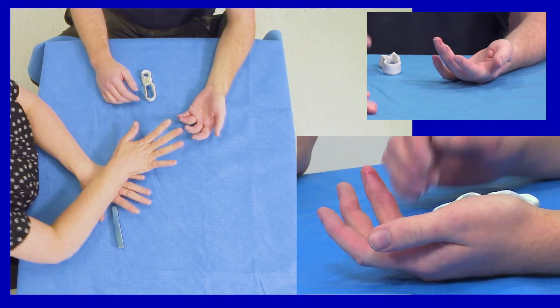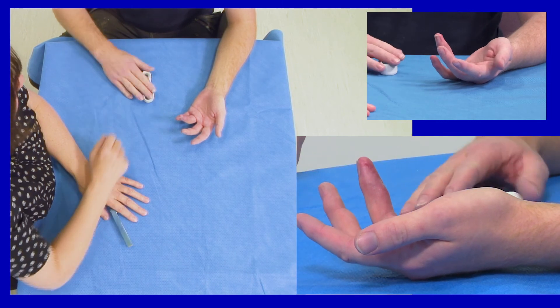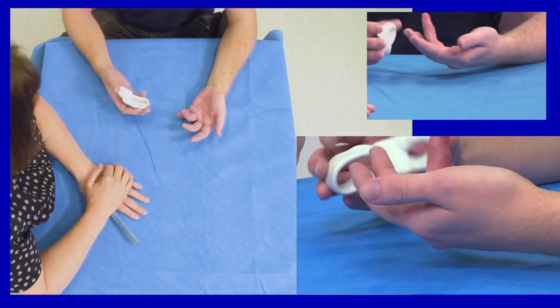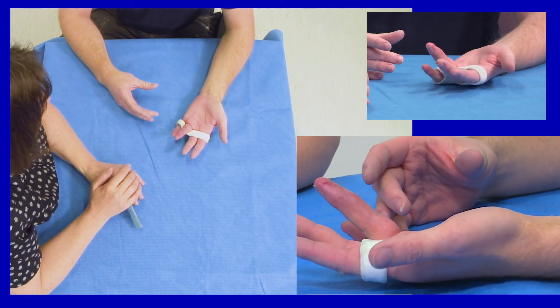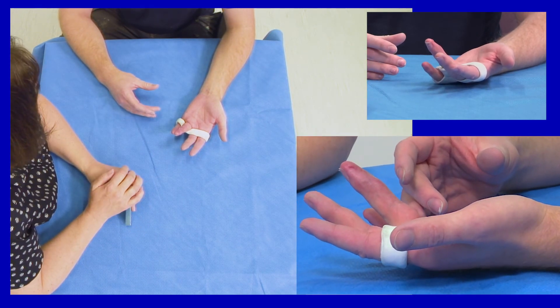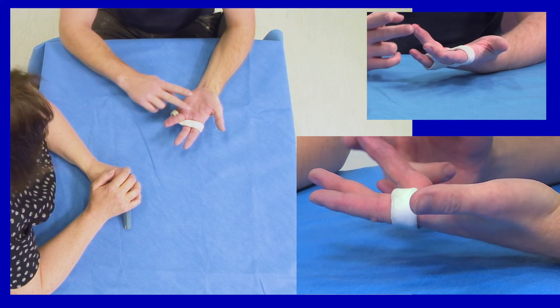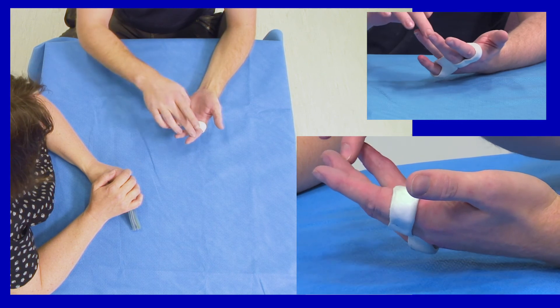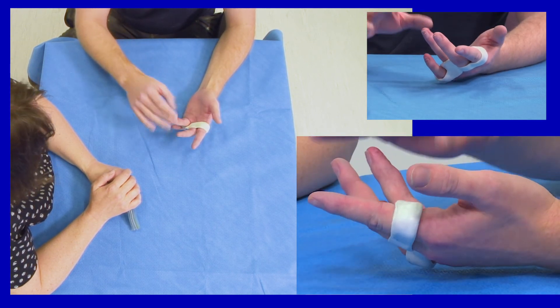And in between your exercises, what do you do? How much of the time do you wear that? I've always been wearing it — all the time. And what can you do with your hand with the splint on in between exercises? Provided I wasn't using anything to restrict it, I was able to use these three fingers, but I tended to just use these two and keep well away from that.